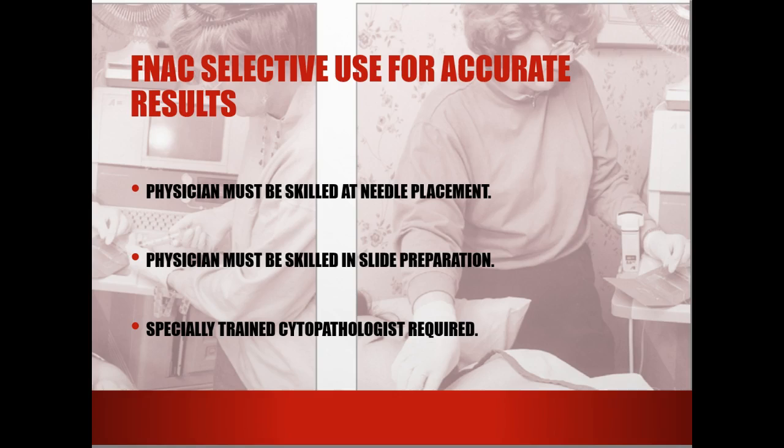The other thing is, it really has to be well timed. So the mammography department needs to schedule that needle localization on the same day that they're having the surgery. Say, for instance, the surgery is scheduled for 3 p.m., you're probably going to want to schedule the needle localization in the mammography department, say around 1. And everything has to fall into place. Often the surgery may not be able to be done when the needle localization can be done, and vice versa. So it takes a lot of coordination between the two departments.